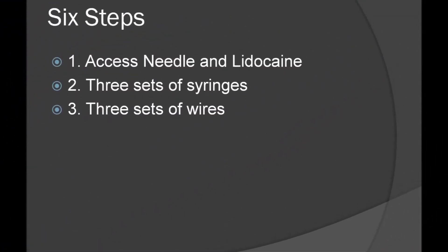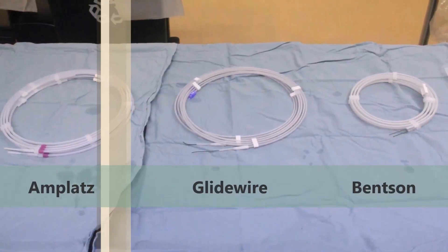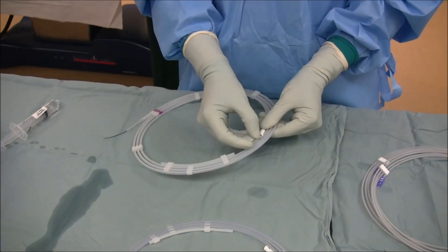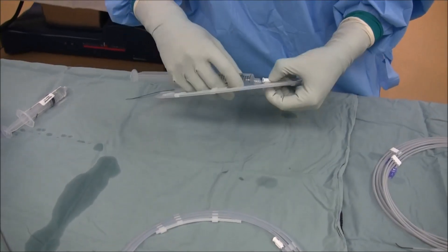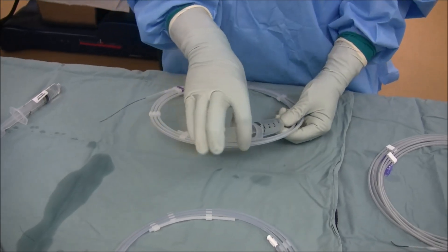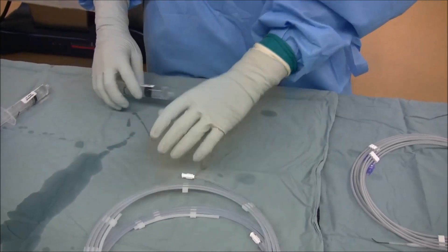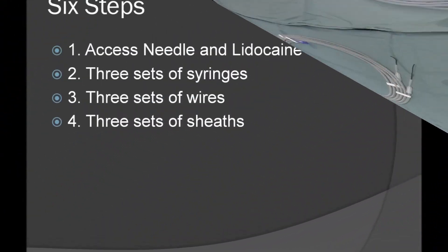The third step is to prepare three sets of wires. Two each of the green wire, blue wire, and black wire are sequentially flushed. It is important to advance the blue wire prior to flushing the flush port, as shown here. All of the remaining wires are similarly flushed.